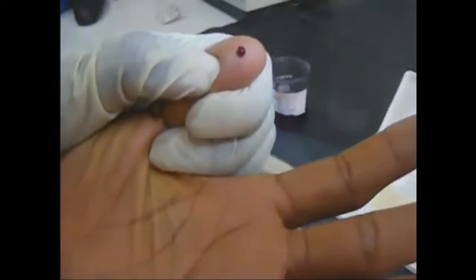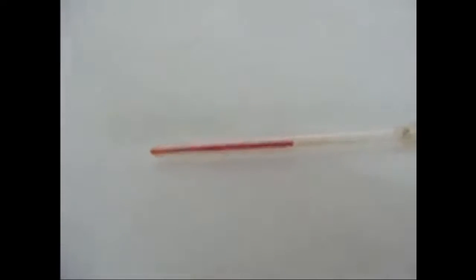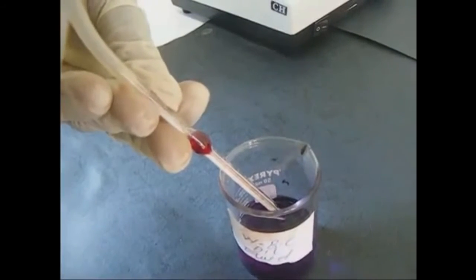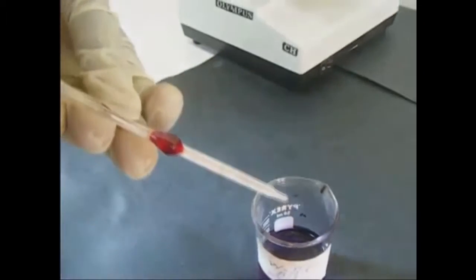The lancet is used to prick the tip of the thumb, and the blood is pipetted with a white blood cell pipette and brought to the 0.5 mark. The pipetted blood is then diluted with the white blood cell diluting fluid to the 11 mark.